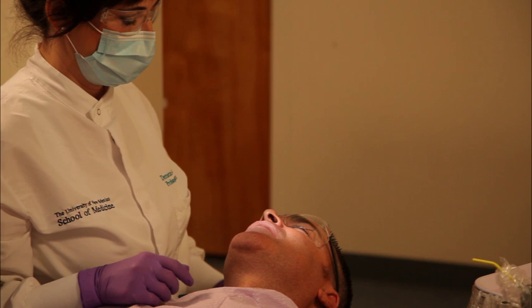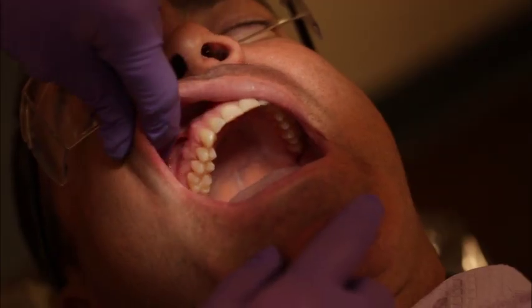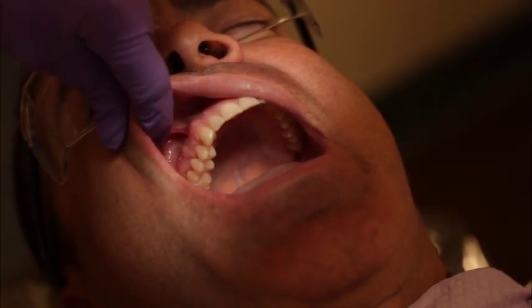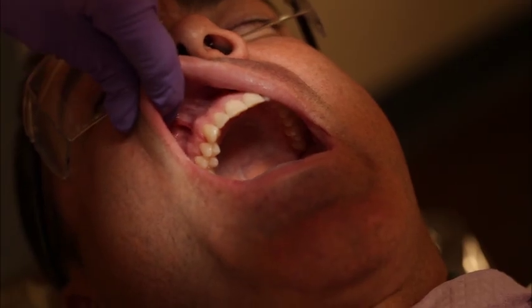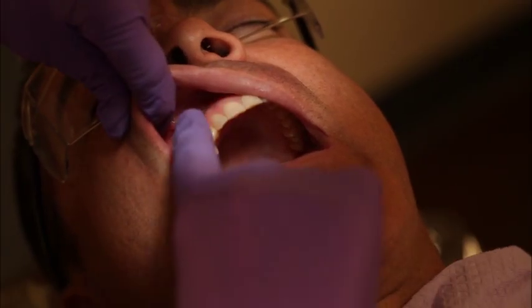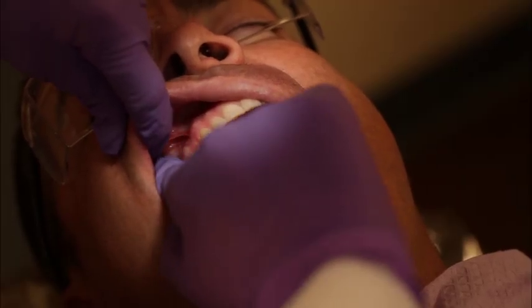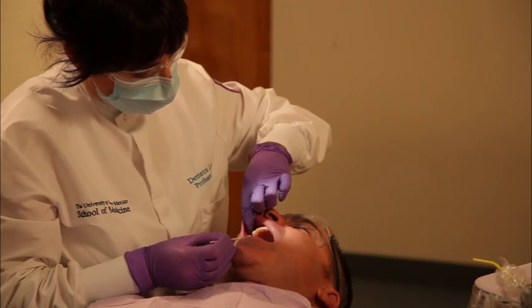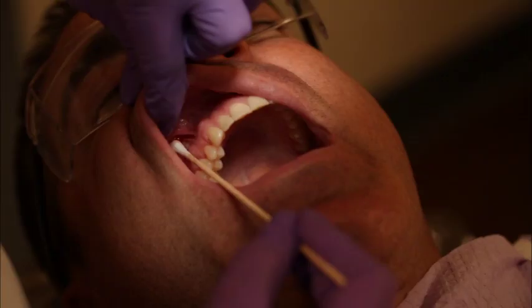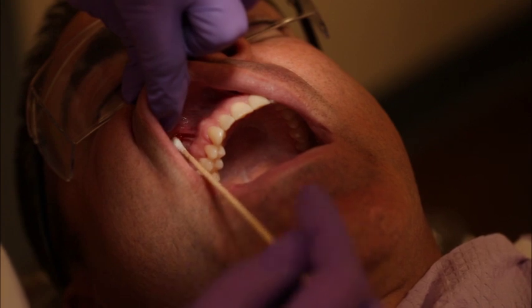Ask the supine patient to open his mouth and then retract the upper lip, pulling the tissue taut. You may use a piece of sterile gauze to help retract slippery tissue. Pull the upper lip more anteriorly to avoid having to go through any large frena. Palpate the zygomatic alveolar crest to ensure that you will not contact bone prematurely and determine the apex of the maxillary second premolar. Dry the penetration site and prepare the alveolar mucosal tissue with topical anesthetic in the vestibule at the height of the mucobuccal fold superior to the apex of the maxillary second premolar.